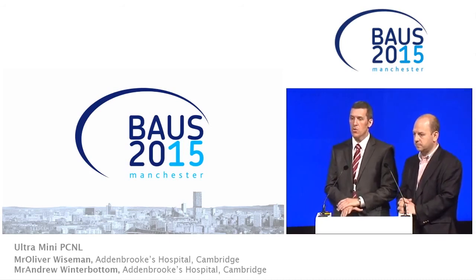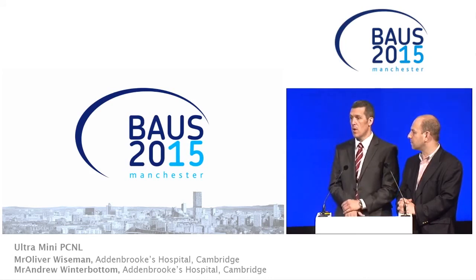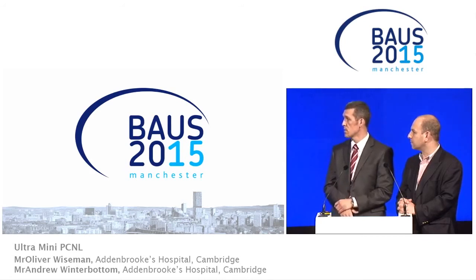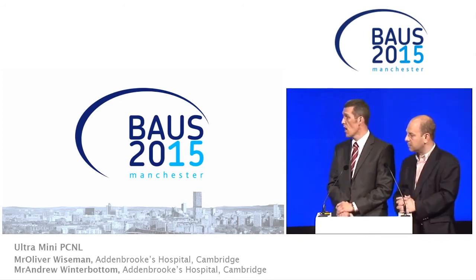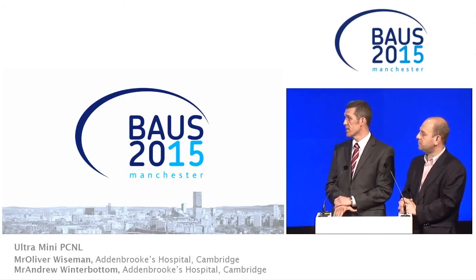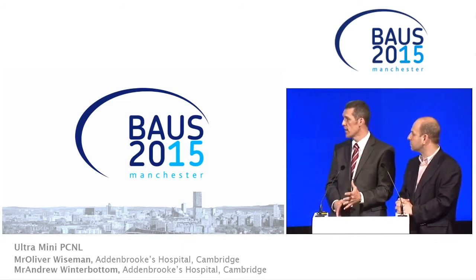Having said that, for those trained with fluoroscopy, it works. You have to image in 2 planes to target the calyx after you've done your retrograde. So it's whatever you're used to using. There are some occasions when I've targeted the kidney with ultrasound and then we just use the retrograde to fluoroscopically guide the needle that last bit. But as a radiologist, I will use ultrasound because that's what I do. I can see the structures in between the skin and the kidney because I'm not just targeting the calyx, I'm avoiding these other structures.